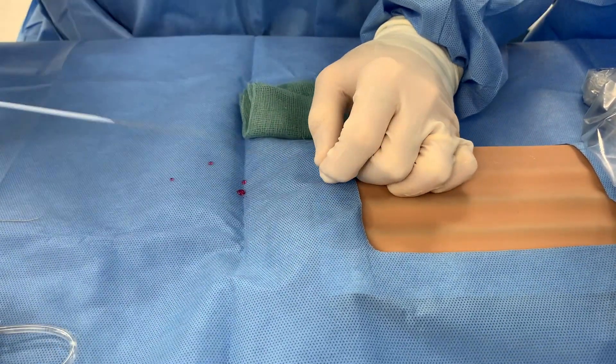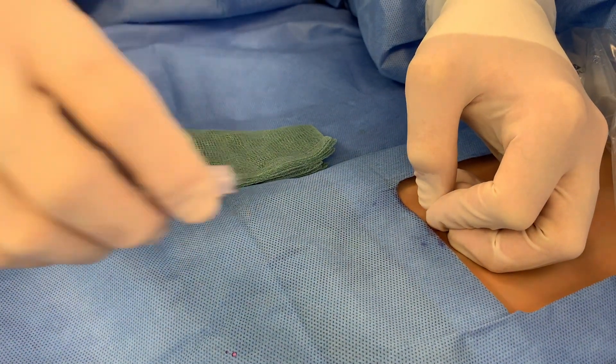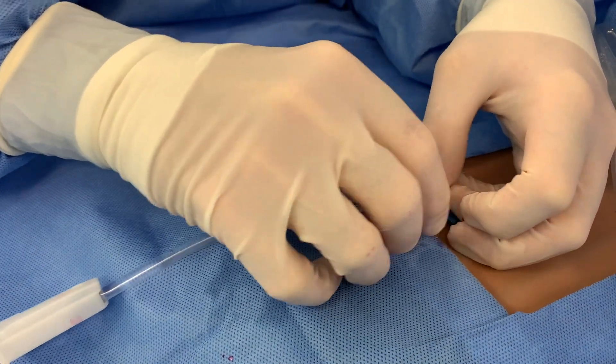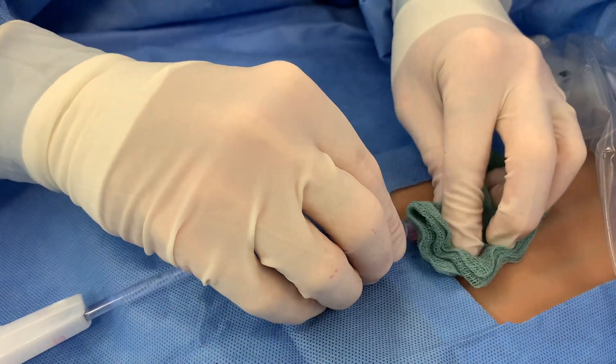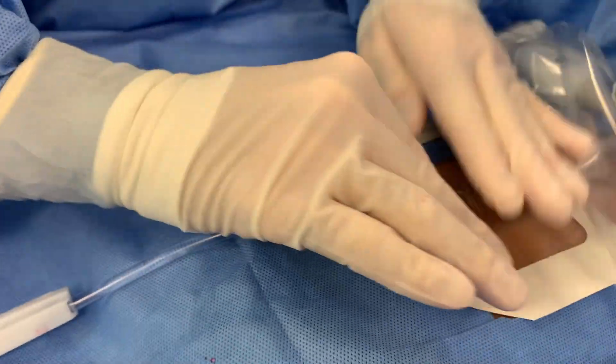Remove the inner dilator and wire and attach directly to intravenous administration tubing. Stitch the catheter in if required and cover with a transparent dressing.